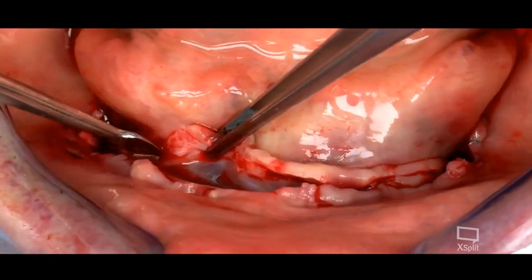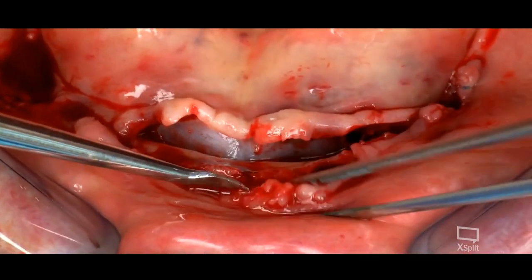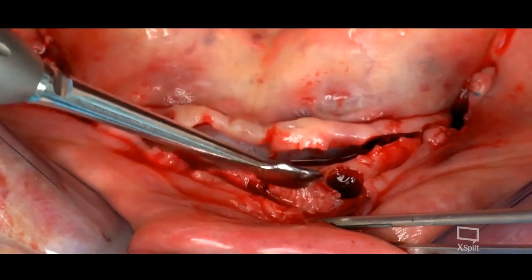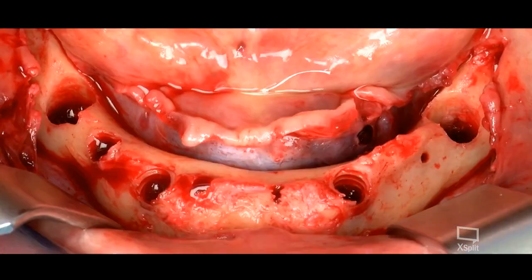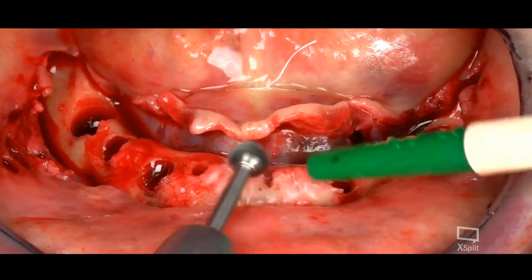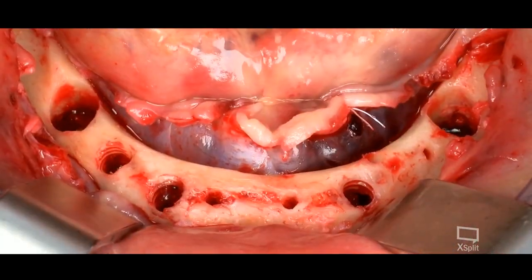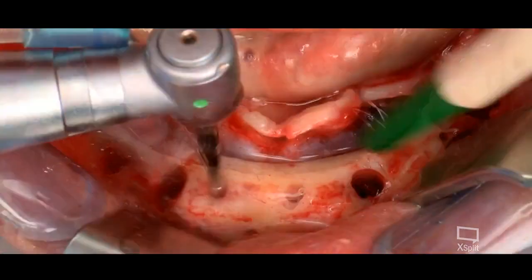So the doctor opened the flap and ground the bone just to remove this ridge. You see that here, you take it and remove the ridge a little bit. You make all the bone much softer and much cleaner.